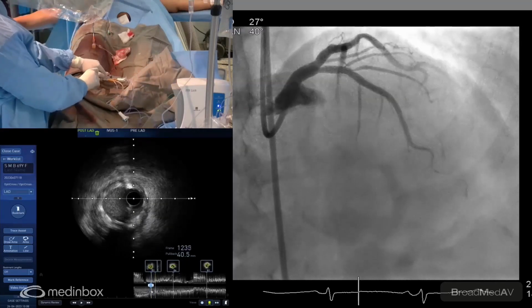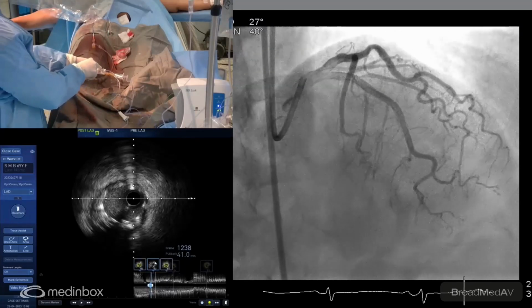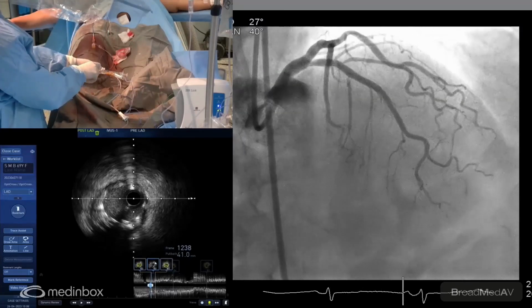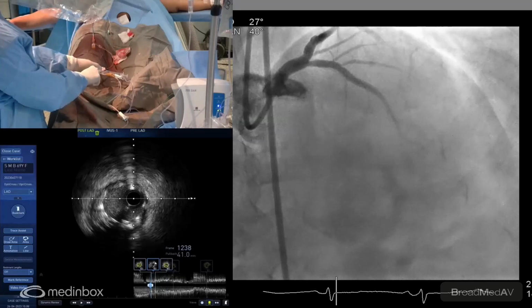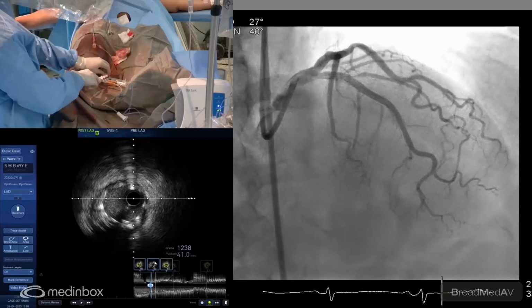You can see that the result is looking very good. In fact, the proximal LAD stent is bigger than the native LAD ostium. The diagonal is still preserved, and that is the great part about using debulking devices. Take a perpendicular view.